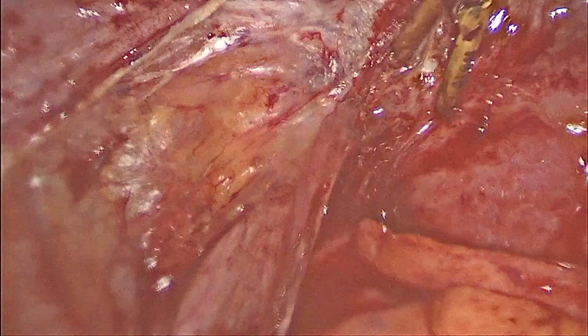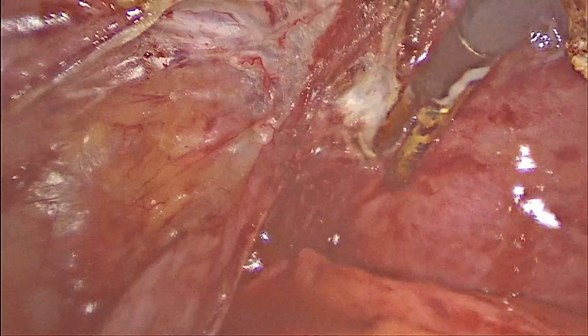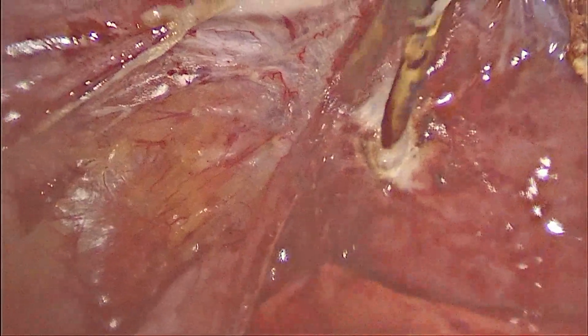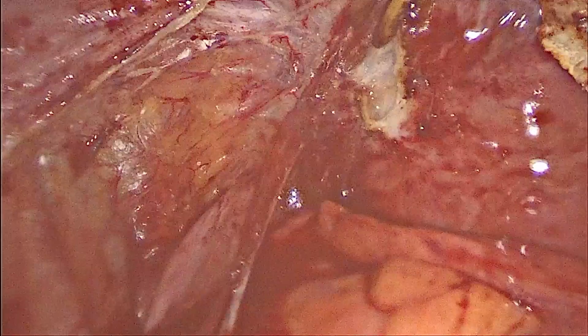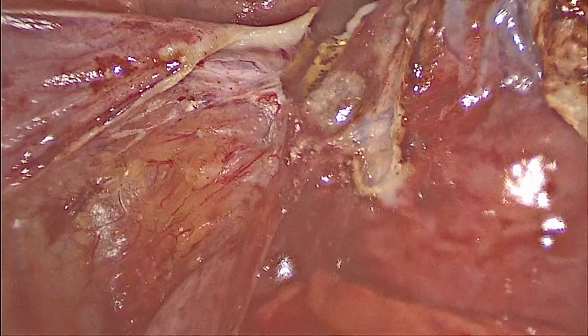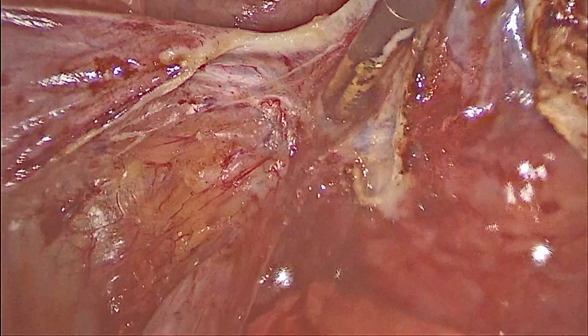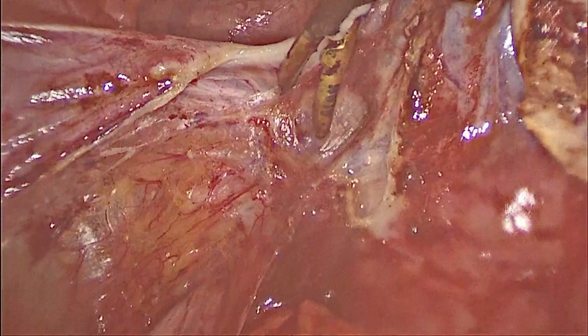Now we have to separate the uterovesical fold of peritoneum from the cervix, and the rectum from the posterior surface of the cervix. Both are adhered. We can see the ureter is very close to the site of surgery, so we keep identifying it throughout its course.